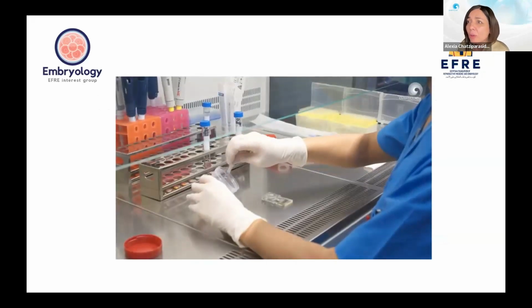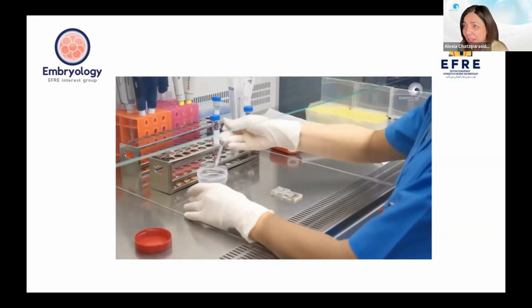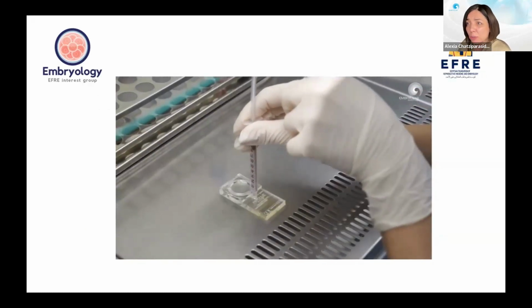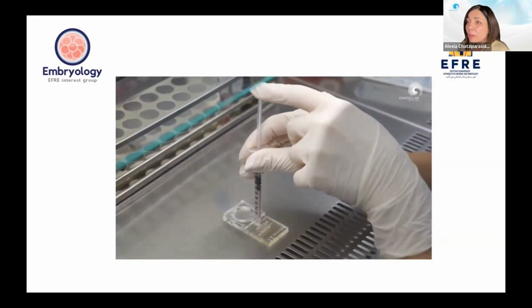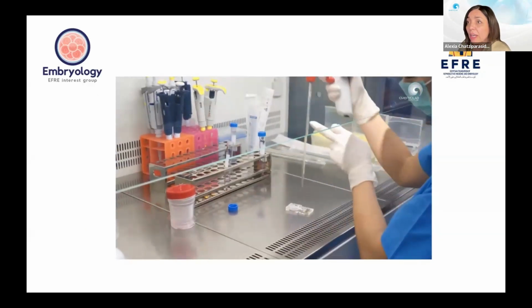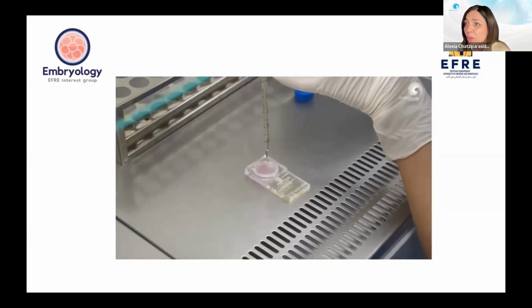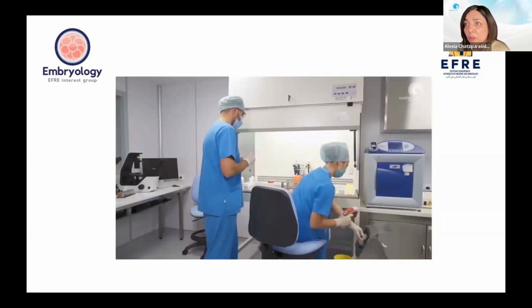But let me share with you our experience. We've tried to assess DFI, DNA fragmentation, in each sample when it's raw, after gradient, after swim up, and after microfluidics. Obviously, this was limited only to the sperm with good numbers of motile spermatozoa. And to our amazement, we found that the lowest DNA fragmentation was after Zymote. And obviously, we talk about good quality sperm.